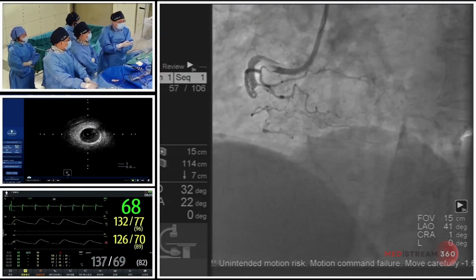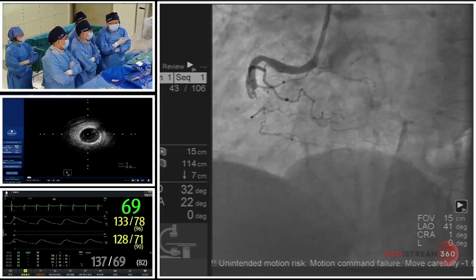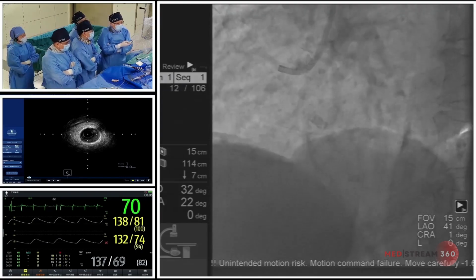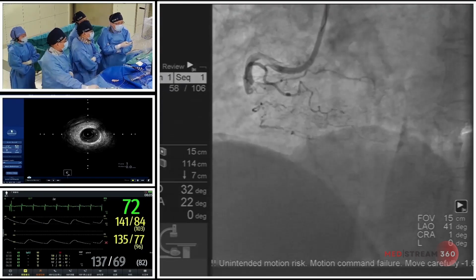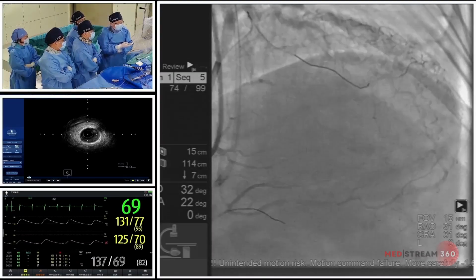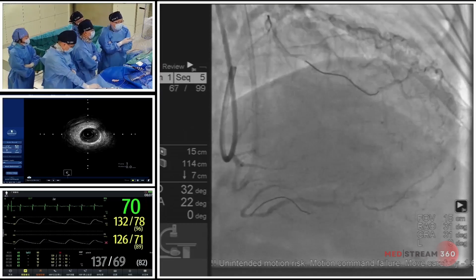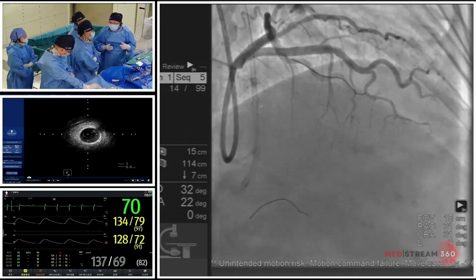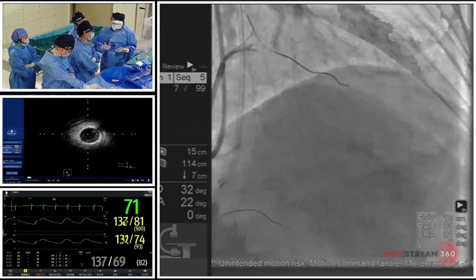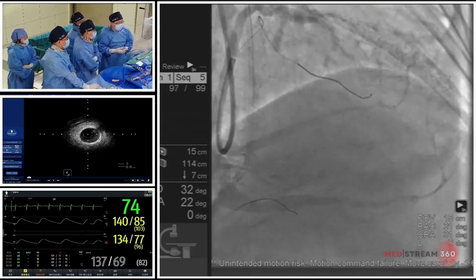Okay. Yes. From the angio, we can see a proximal middle portion occlusion, and there is a large side branch, and we couldn't see the stump. Then this is a left coronary artery angiogram. We use a BR30 guiding, and one tip and trick is to put a workhorse wire to the circ to give the guiding backup support, because we also could see the left main is very short.